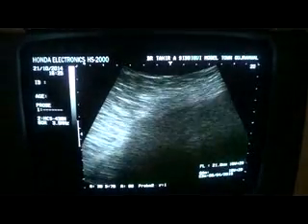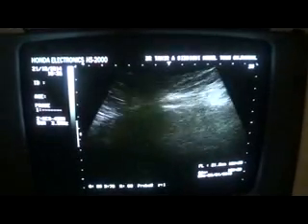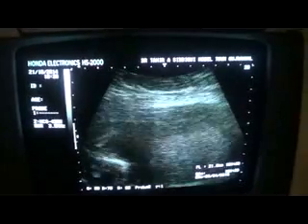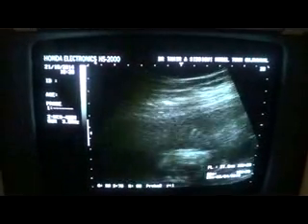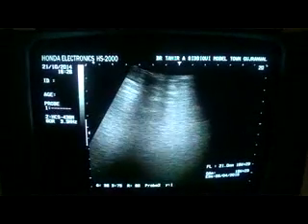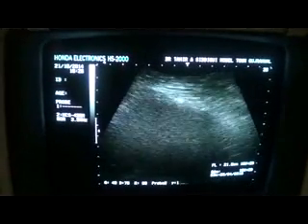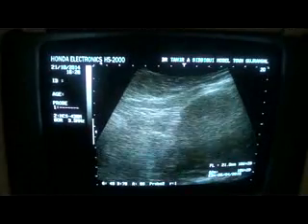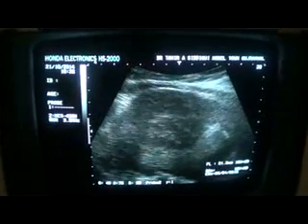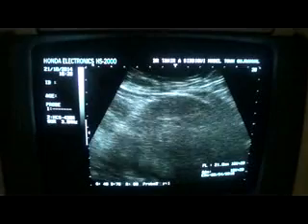Okay, now when I proceed a bit further upwards, towards the fundal region, this is the uterine fundal region, and here you will again see a mass of fibroid that relates to the uterine fundal region.